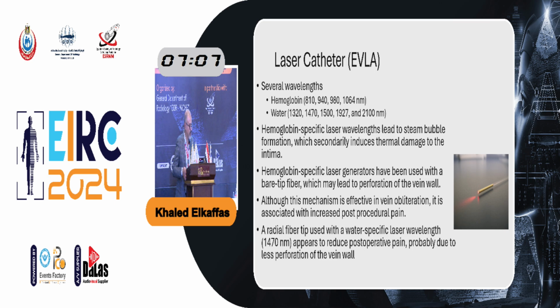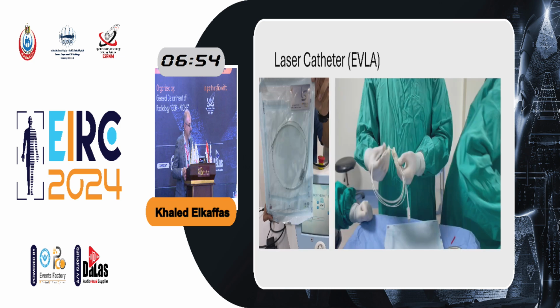The newer catheter is a radial fiber tip, with water-specific laser wavelengths like 1470, and it appears to reduce post-operative pain, probably due to less perforation of the venous wall. Here is the catheter of the laser fiber, and here is the unfolding of the catheter.